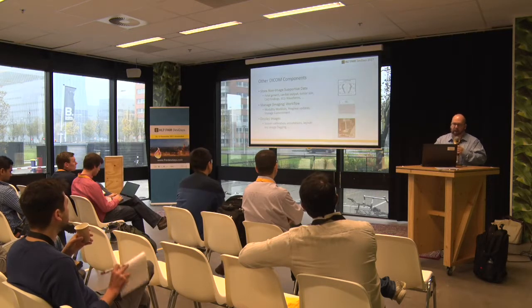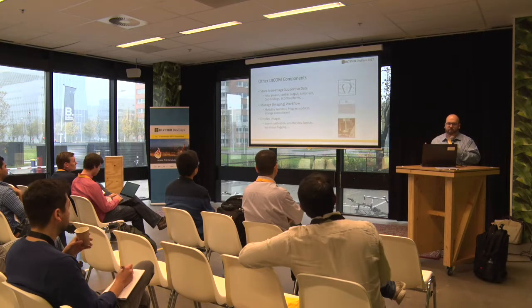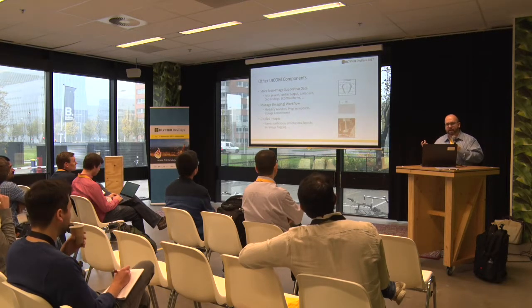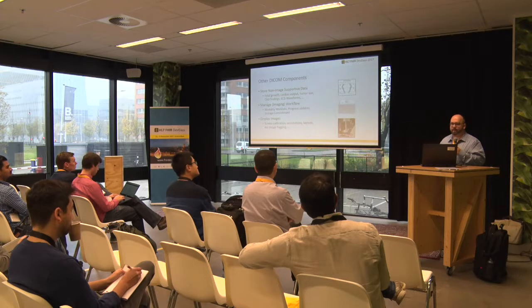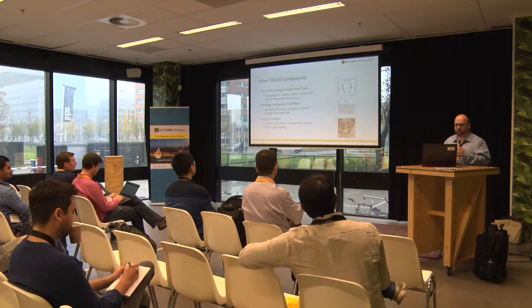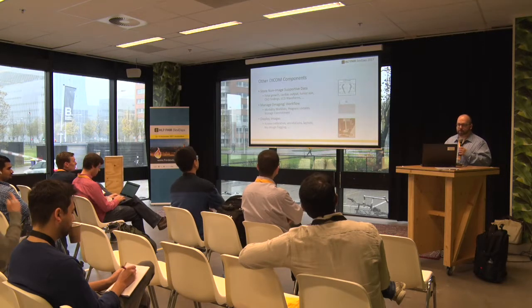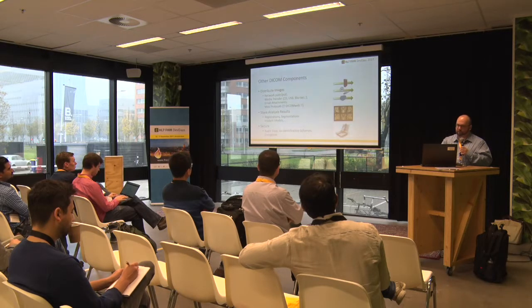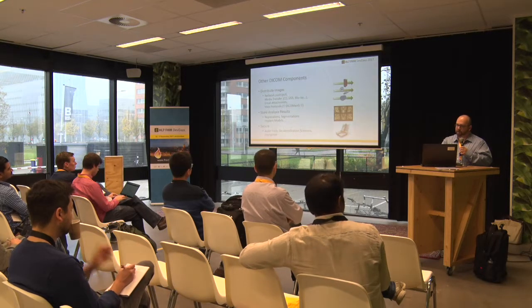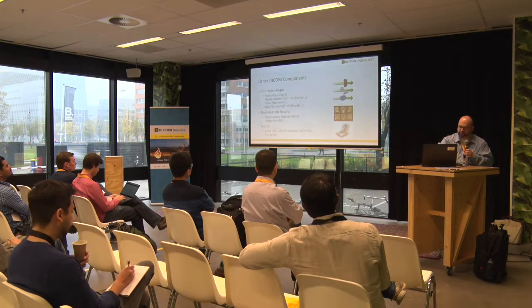Aside from images, there's also the non-image supportive data. You might think of this maybe like metadata, but it captures information about the study. So for example, if you've ever seen a fetal ultrasound, they measure crown, rump, and femur. These are measurements that are kept with the images and are transmitted to other systems. We also have the modality worklist. We could do procedure step updates as the patient moves through the system. And there's also a whole aspect in terms of displaying the images. There's also distribution of images, storing analysis results, and there's a security model as well.